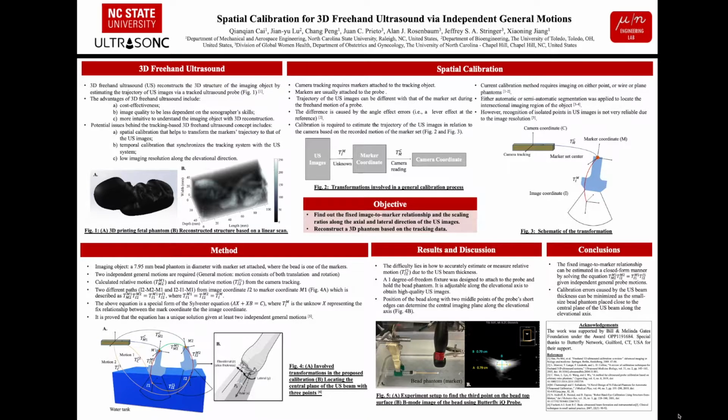3D freehand ultrasound reconstructs the 3D structure of the imaging object by estimating the trajectory of ultrasound images via a tracked ultrasound probe. Figure 1 shows our previous result to reconstruct a printed 3D fetal phantom based on a linear scan. There are multiple advantages of 3D freehand ultrasound.